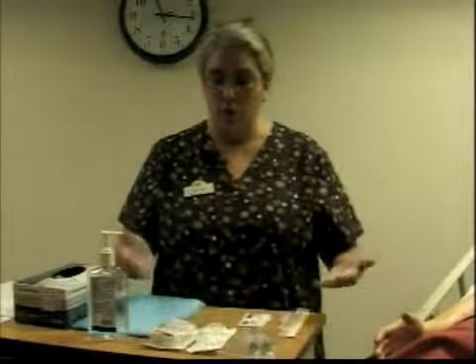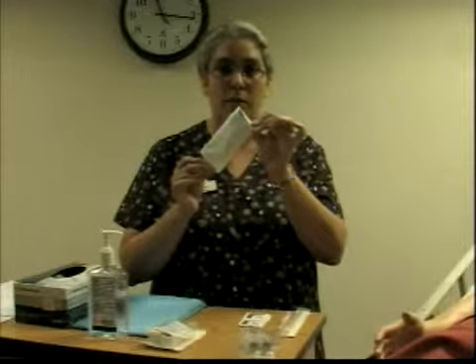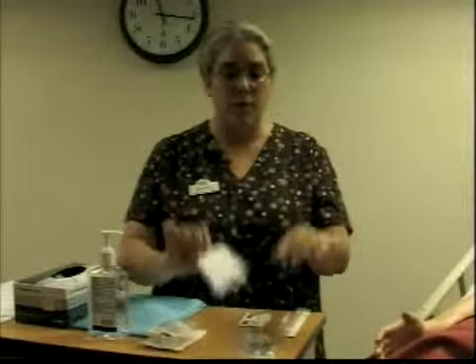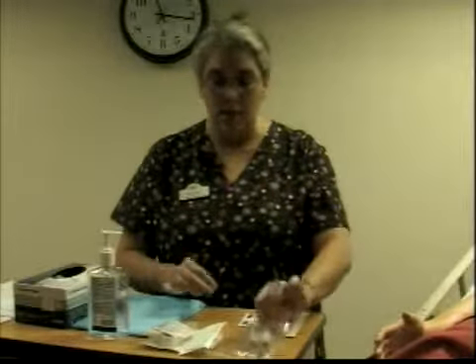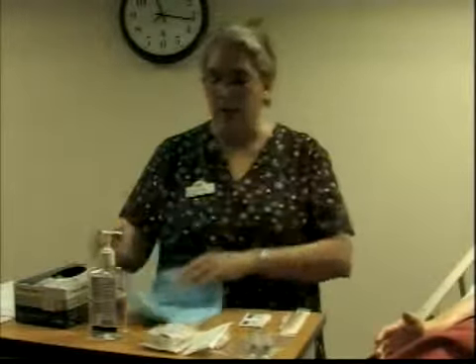So make sure you have all your supplies. There is a pre-packed IV start kit that your institution will have. Then you have your extension tubing, which you're going to prime with saline and connect your IV fluids to. You have your saline flushes, which will be labeled as such, and you want to make sure that it is saline. You have a blue chux that can help you collect any blood that you might spill. Of course, your gloves, your hand sanitizer, wash your hands before you come in, and any extra supplies that you think you might need.